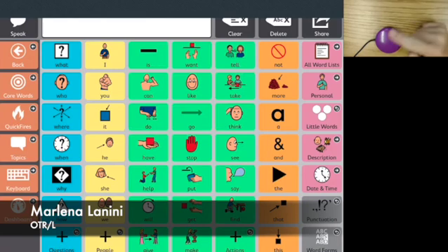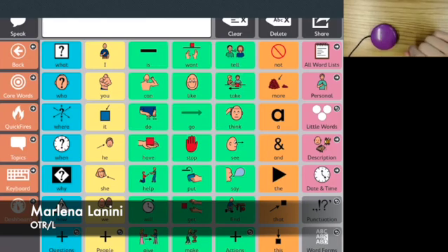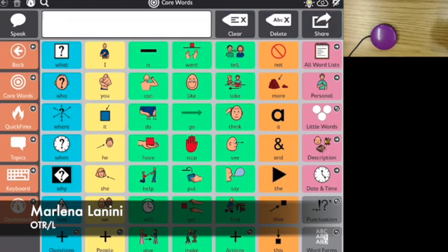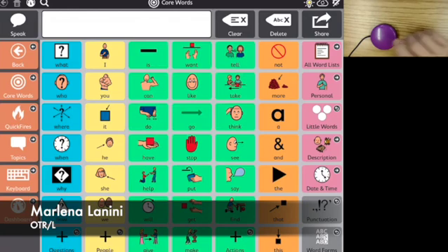I'm going to show you how we can use switches like this one to control a communication device that is accessible with switches. The app that I have here is Tobii Dynavox Snap, but there are several other switch accessible apps that are going to work fairly similarly.